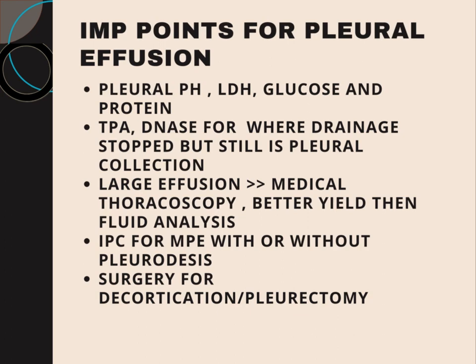We are using IPCs, indwelling pleural catheters. I think you've delivered a presentation on indwelling pleural catheters for malignant pleural effusions. They have a beneficial effect for patients diagnosed with malignant pleural effusion, whether it is the lungs or some other malignancies ending up with pleural effusions. So an IPC is a beneficial thing. Whether we can choose pleurodesis with IPCs or not depends on the case; it varies case to case.